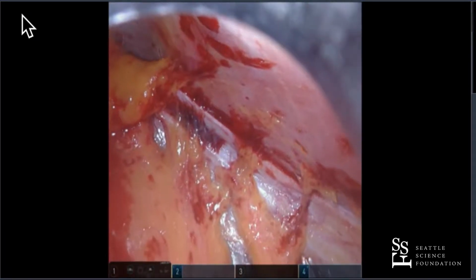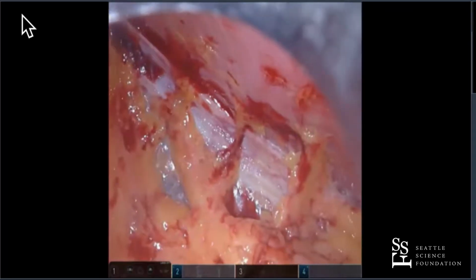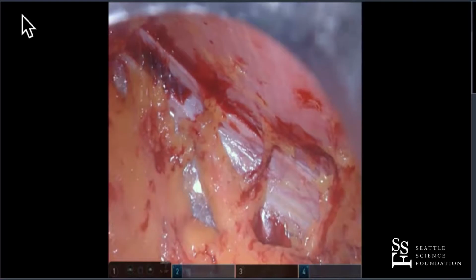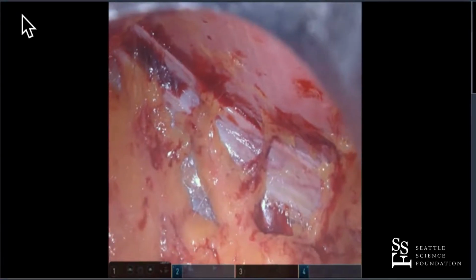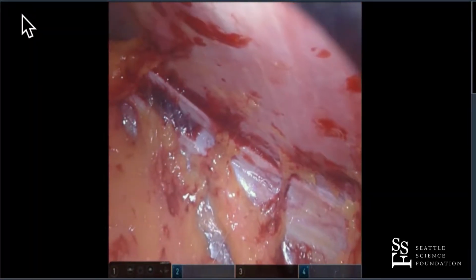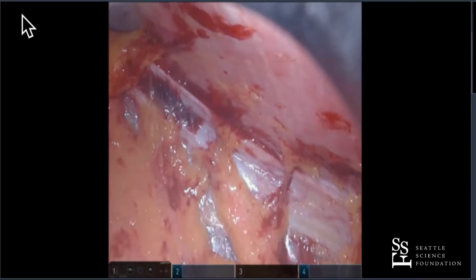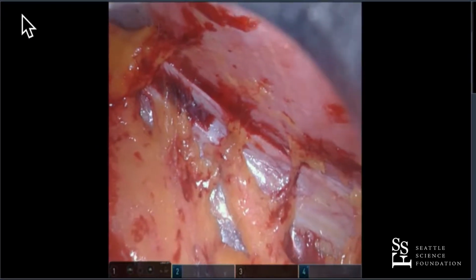So the stick is nice because it's just blunt. A little difficulty here, my point backed out a little bit more than I wanted it to. It's just a straight stick. It's a laparoscopic instrument, a straight stick with a little cotton tip on the end of it. It's really nice for this. You're not going to make a hole.